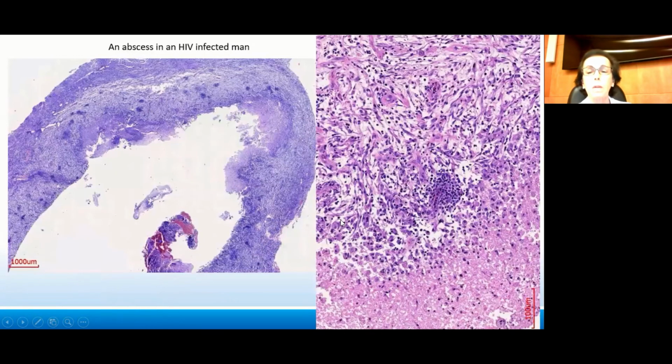Now, it's still with virus. This is an abscess I had, I think 4 years ago. It was operated like an abscess, but the strange thing was there were lots of small nodules here. Looking closer, they were microglial nodules, which are not usual for a pyogenic abscess.